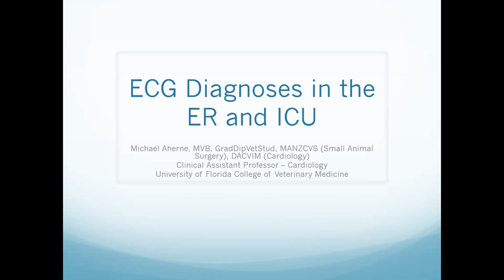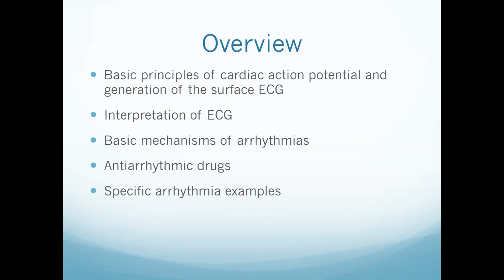So as we move on, just a brief overview of what we're going to talk about tonight. I know we're specifically looking more towards ER and ICU ECG interpretations. However, even in that setting, ECGs are applicable to all settings, so it's going to be somewhat of a broad overview of arrhythmias overall.